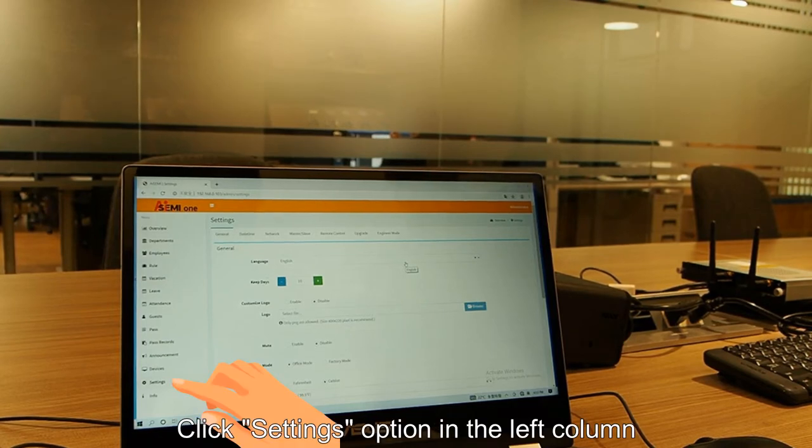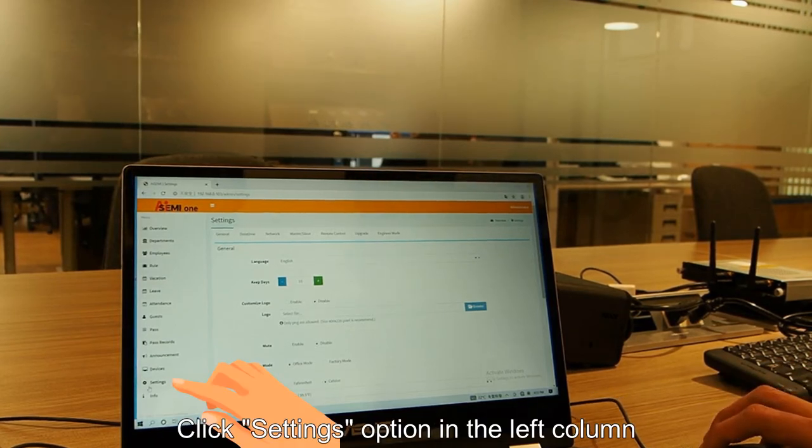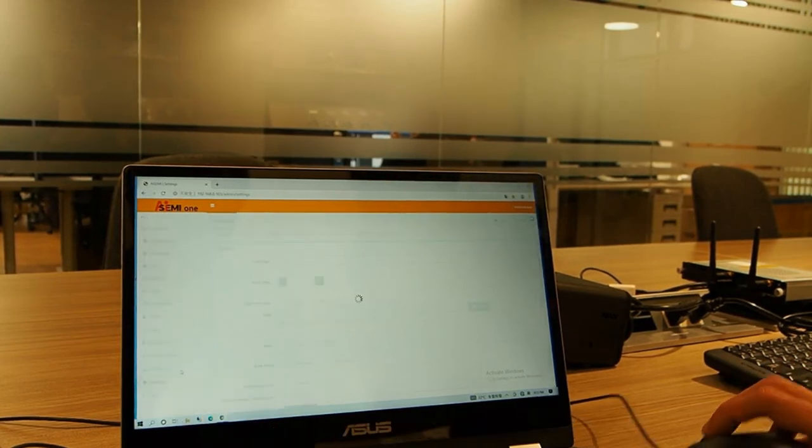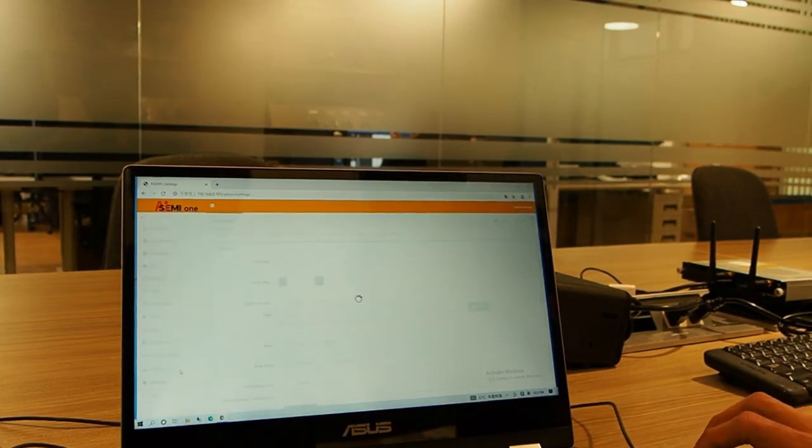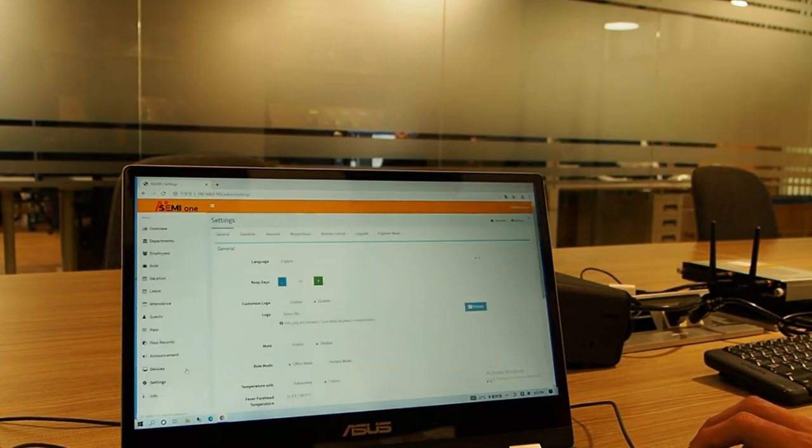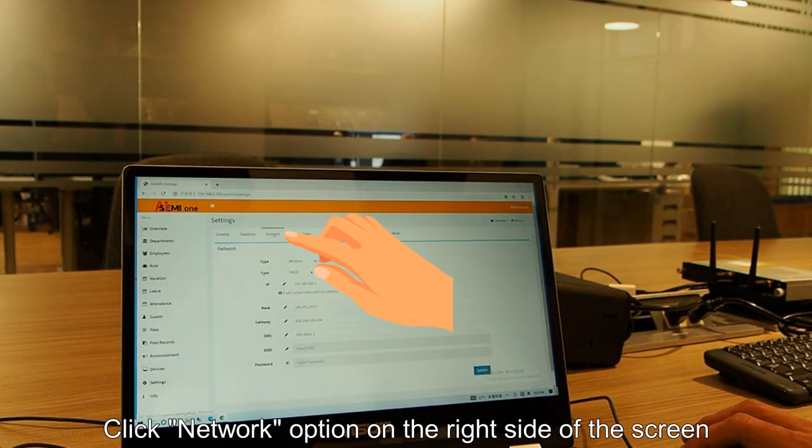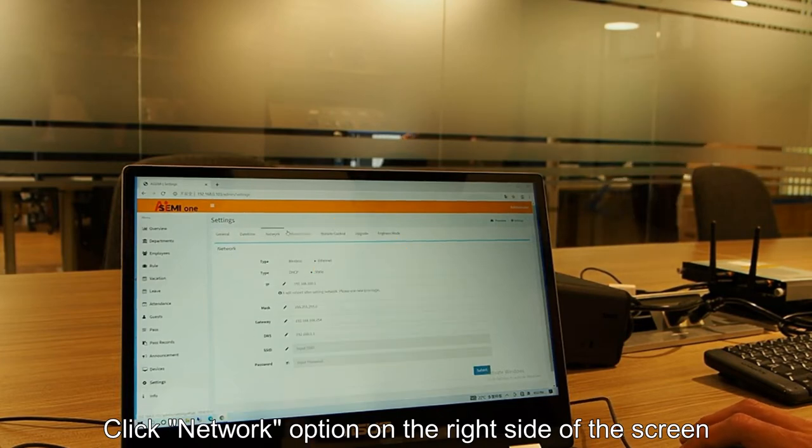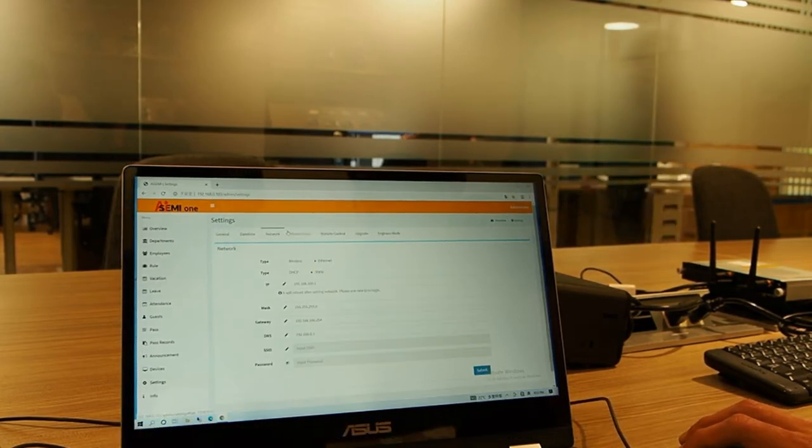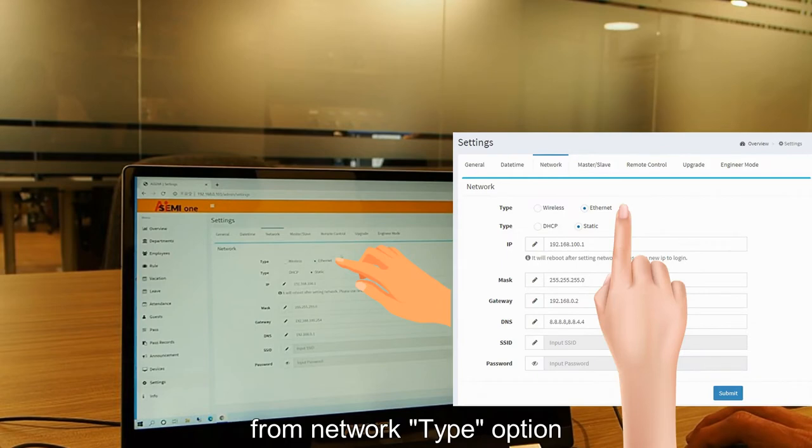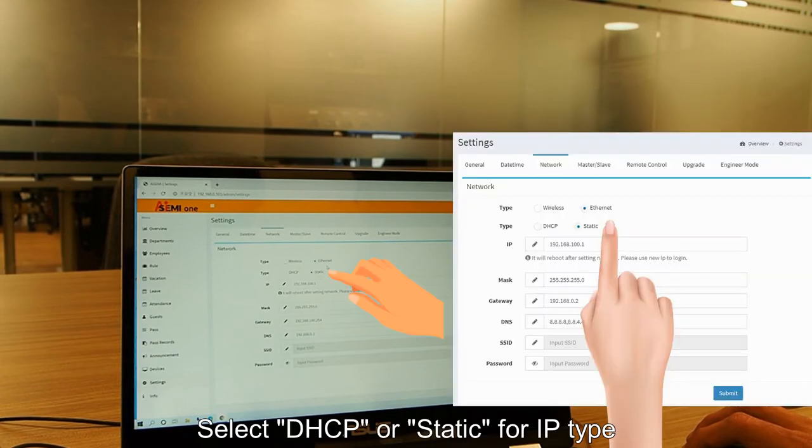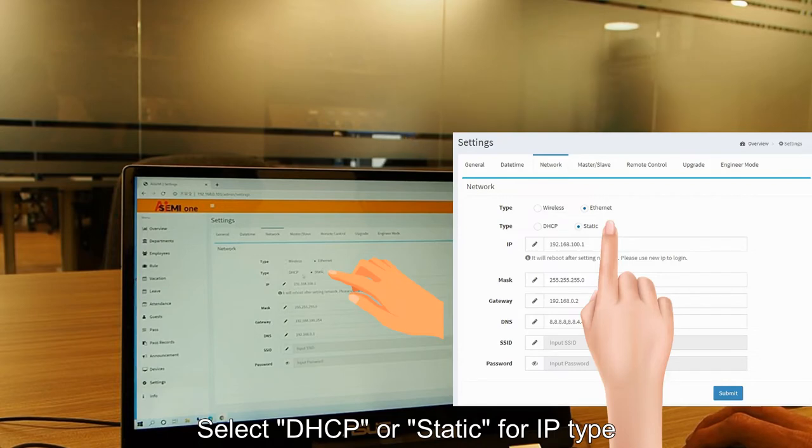Click settings option in the left column, then click network option on the right side of the screen. Select wireless or ethernet from new network type option. Select DHCP or static for IP type.